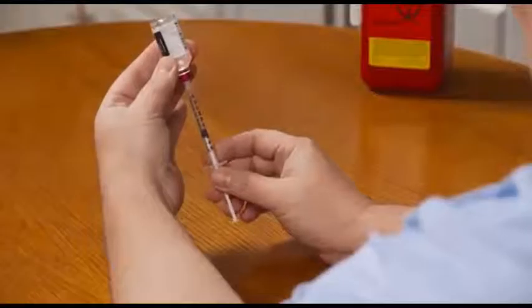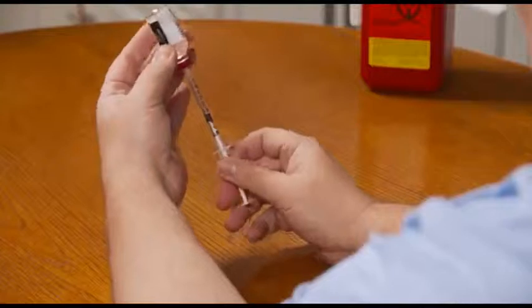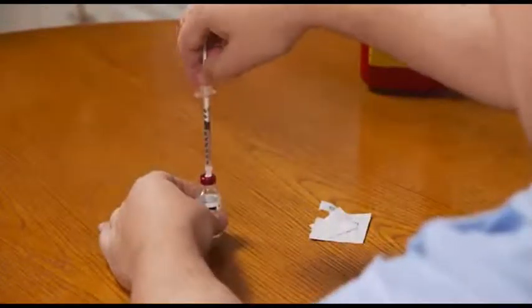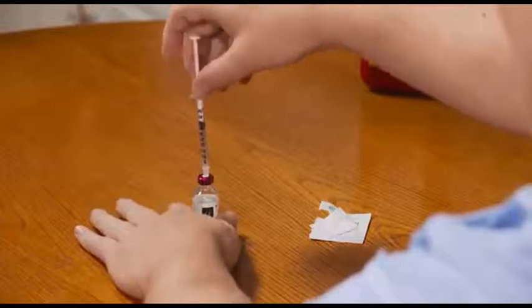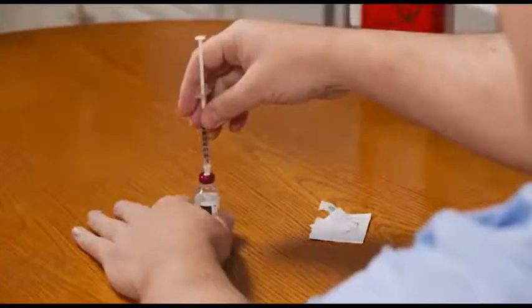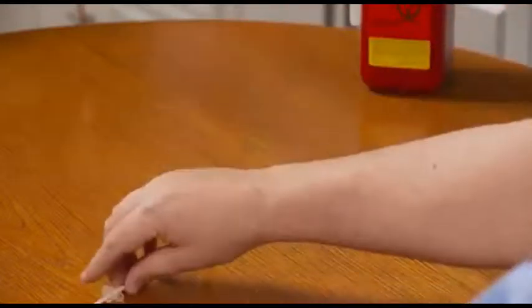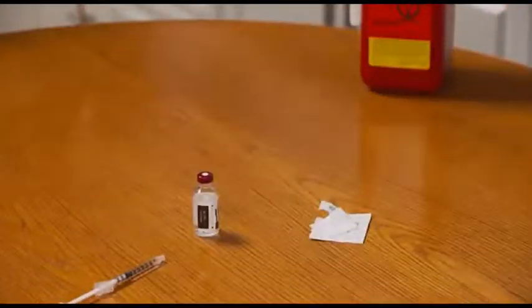Once you've drawn up your dose without any air bubbles, turn the syringe and the bottle back over and place the bottle on a flat surface. Then, holding the syringe by the barrel, carefully pull the needle straight out of the bottle and place the syringe on the flat surface as well, being careful not to let the needle touch the surface.